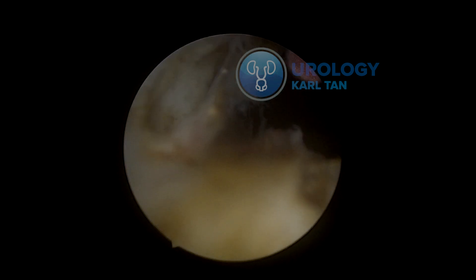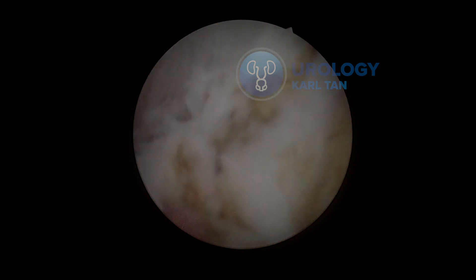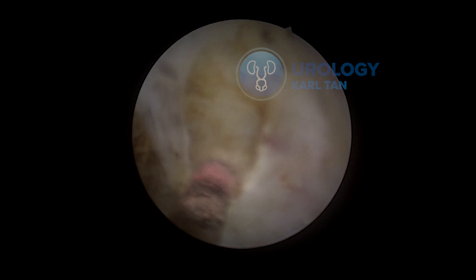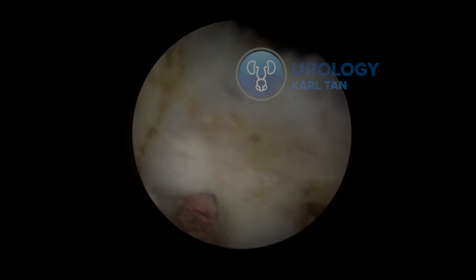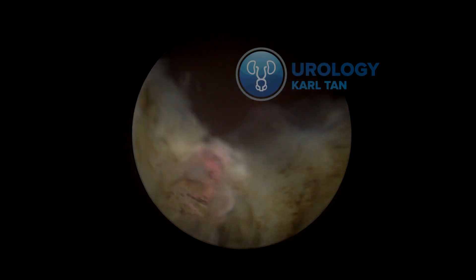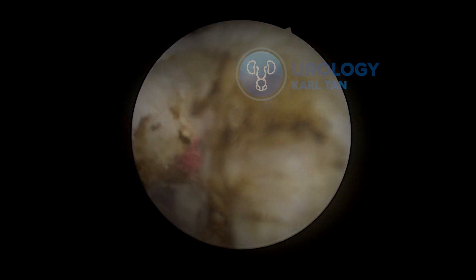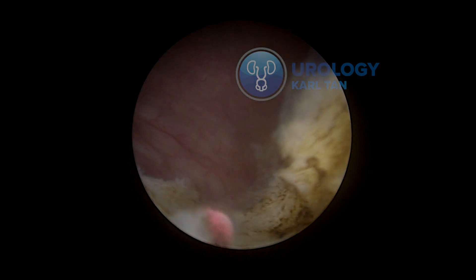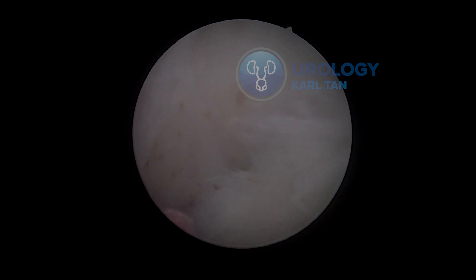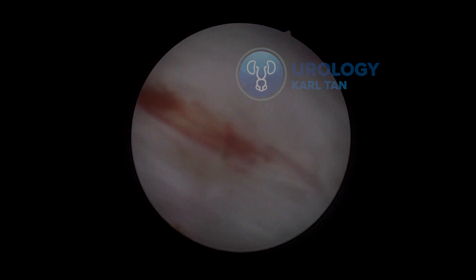Here I'm trying to free the lateral lobes — always going from the bottom to the top, trying to find the proper plane between the prostate gland and the capsule. Now I'm doing the same on the right lateral lobe, trying to release the bladder neck and the prostate, going to the equator, and then using the laser to help cut through the adhesions where it's stuck between the capsule and the gland.